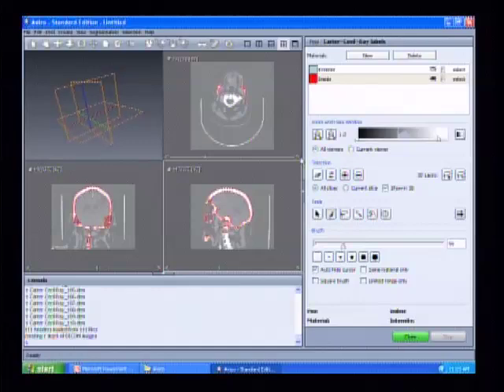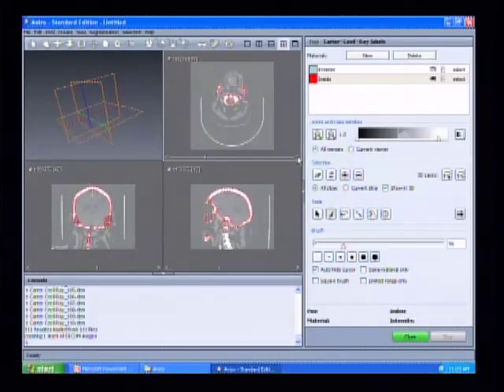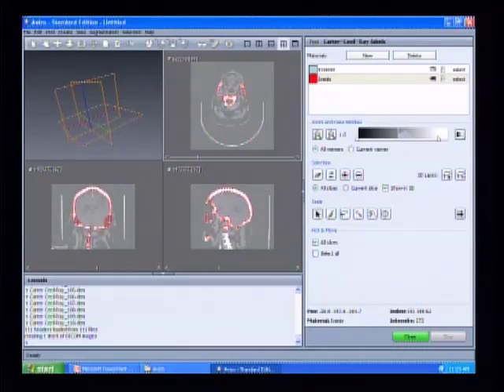So what you could do is, which direction am I going? I'm going up. So let's find my slice here. I've got all of this that's all touching, and then I have the slice that I deleted. Now I can go here, moving posteriorly, and I should be able to 3D select the vertebrae, which is great, because you can see that I've selected it up there, and it's hard to see.